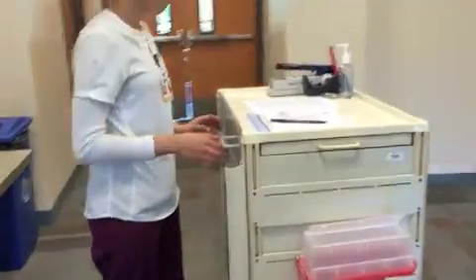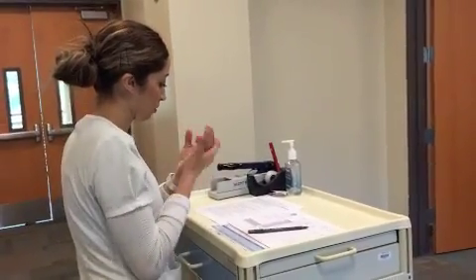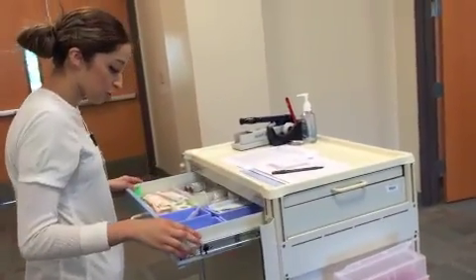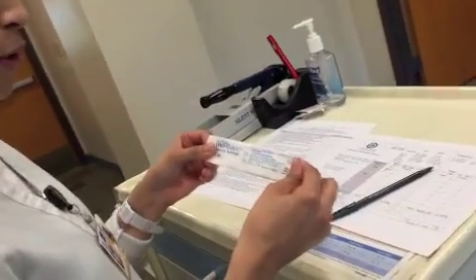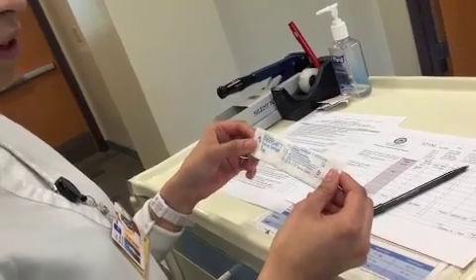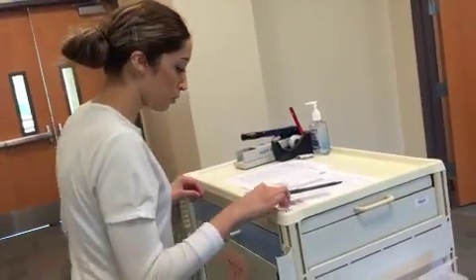So now you open your med cart. Okay, I'm going to perform hand hygiene. Okay, you want to make sure you get your right syringe. So this is a tuberculin syringe, 25 gauge, 5/8 inch needle. You need an alcohol swab.